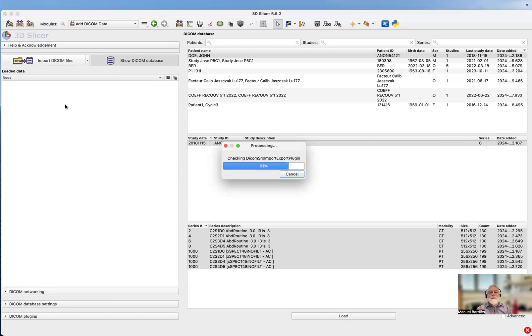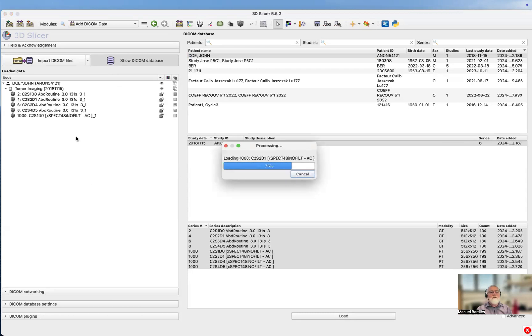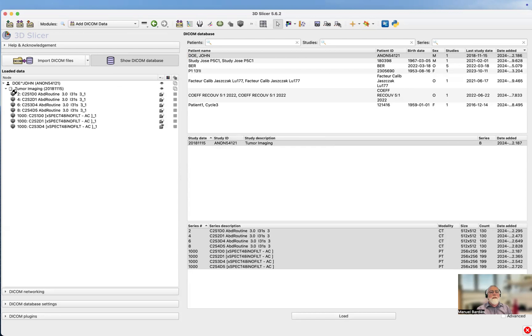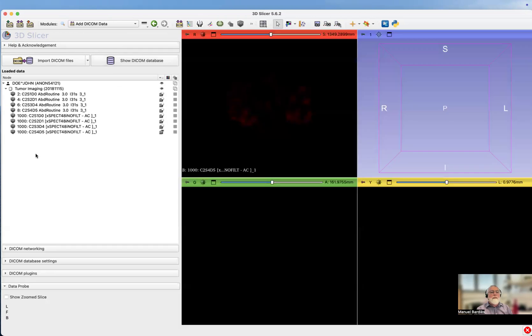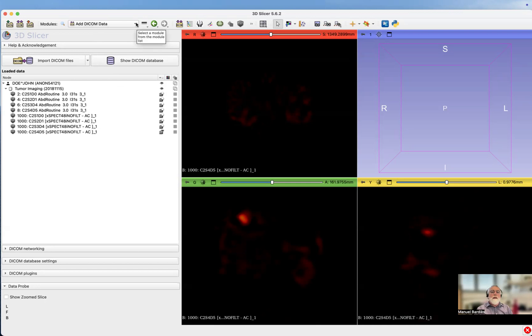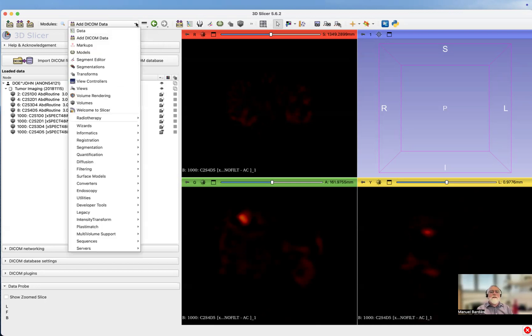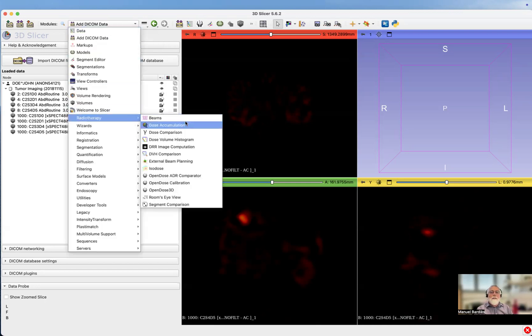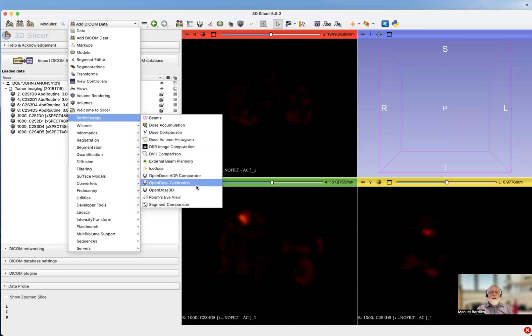Now you can see that we have in the left window the eight files: four CT and four SPECT images. Now we're going to leave the 3D Slicer extension and go directly to OpenDose 3D.